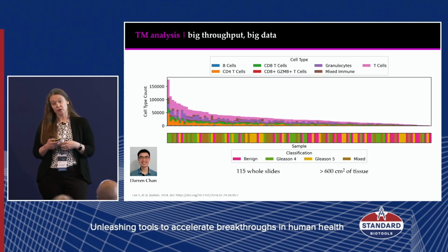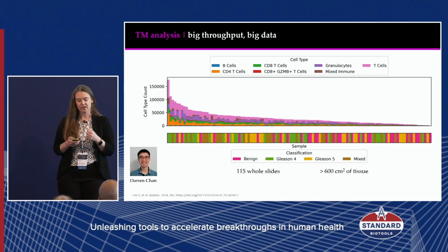This experiment finished running at the end of March. It's the beginning of May. And so we're just starting to apply these methods. Darren here is specifically using Starling, which is a recent preprint from the Campbell lab, looking at an algorithm that does segmentation error aware to help tease apart those markers where you still have something on an edge where you have a CD4 and a CD8 T cell together. And that works well with this 5-micron data.